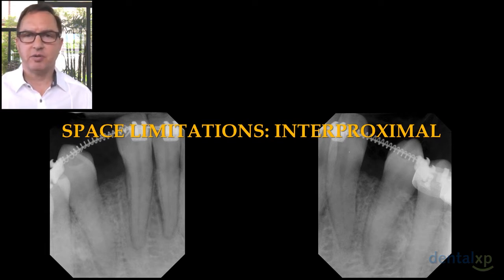She's a female salesperson who has come to the conclusion that after wearing these orthodontic brackets and arch wires, she's interested in getting out of ortho and having a Maryland bridge. She has difficulty speaking and accomplishing her work with the orthodontics in place. And her restorative dentist and her orthodontist had intended to move the cuspids into the lateral position, not realizing that those cuspids were dilacerated.